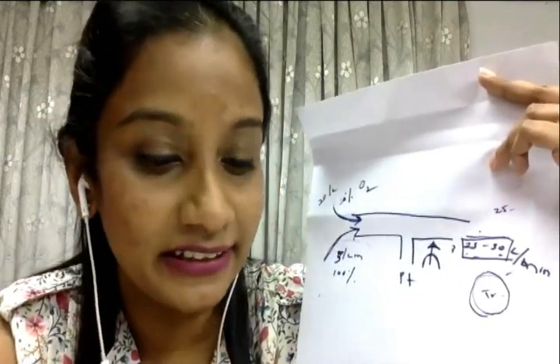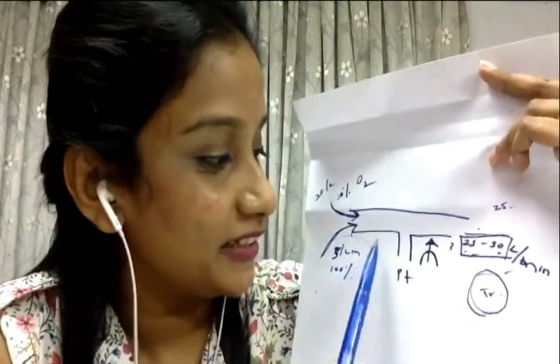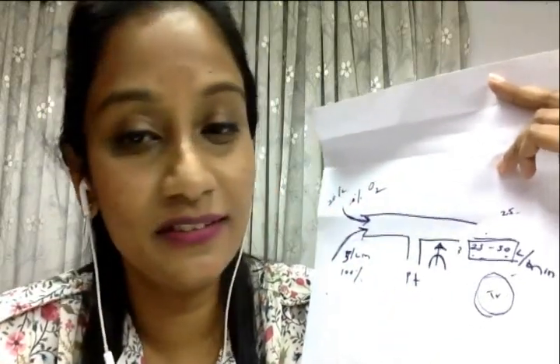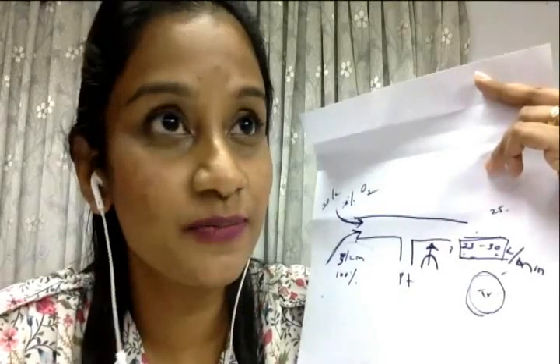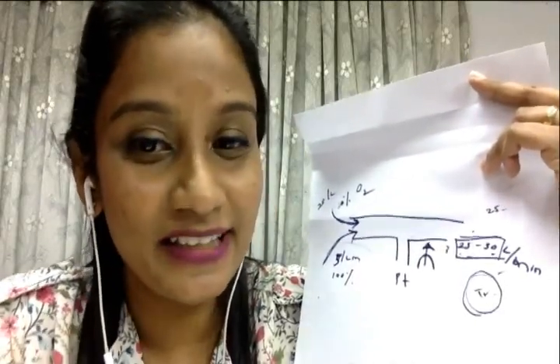The fraction that is being entrained is going to be a pre-decided one. So the patient is going to get a fixed fraction of oxygen. Okay. Did I answer your question? Yes, madam.